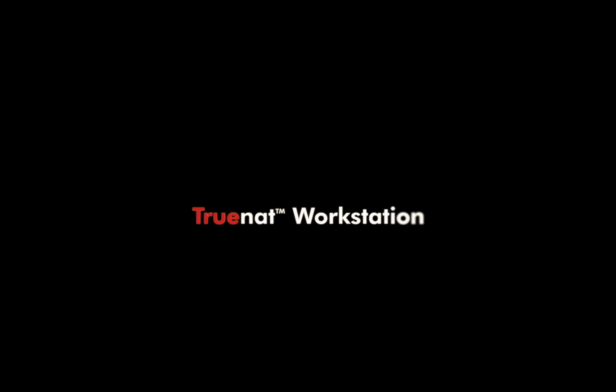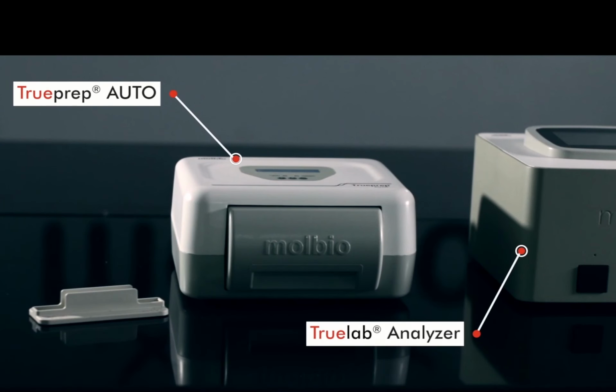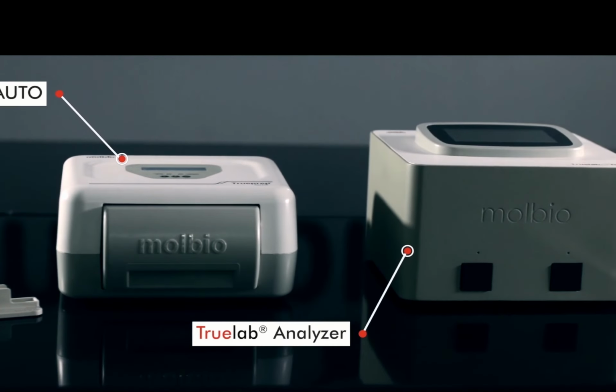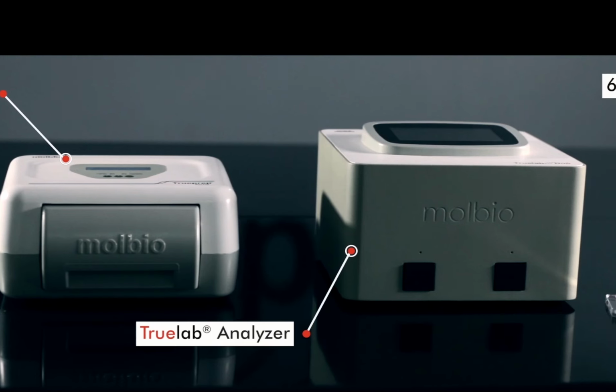Now let's see what the parts of a TrueNat workstation are. First we are seeing this TruePrep Auto. This is the machine which does extraction. There is a buffer pack attached behind it, and extraction is done through a cartridge based kit. Then we have our PCR analyzer, the TrueLab analyzer. What you are seeing here is a two module machine. You can see the two modules here. In most places we have a Uno machine, which has a single module.